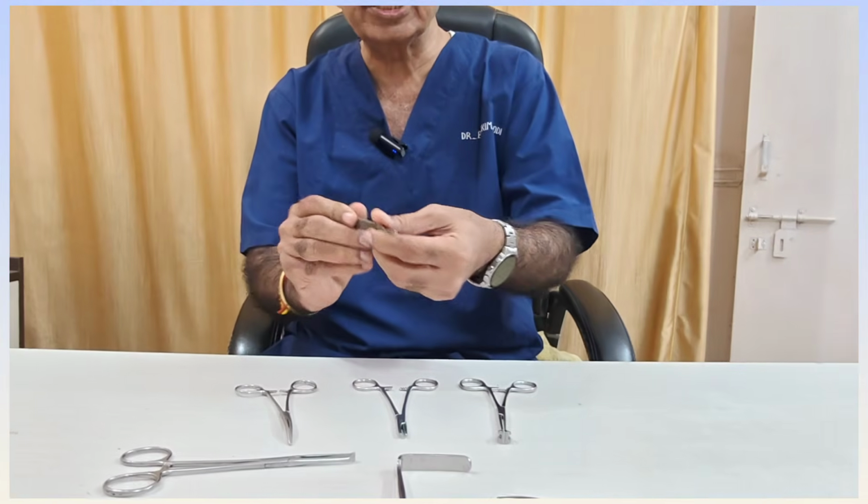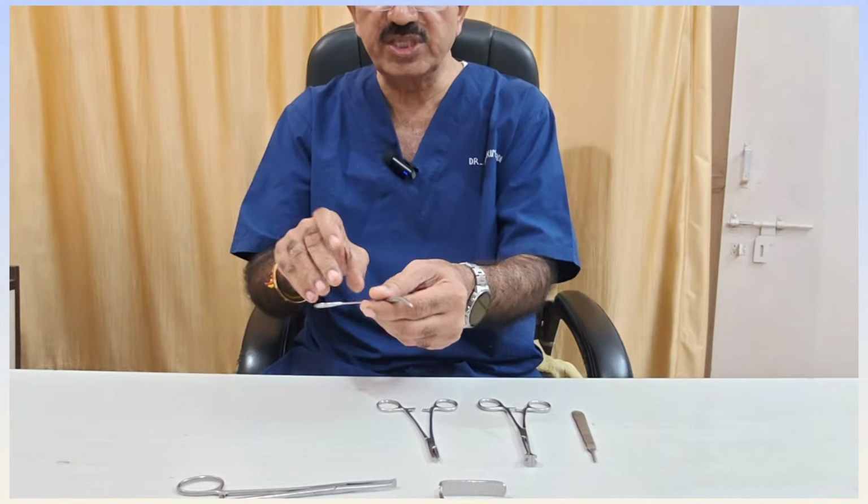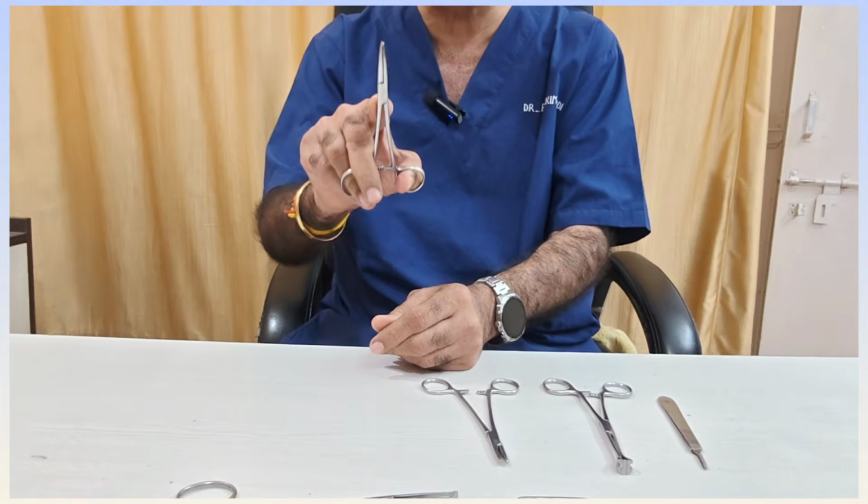Suppose this instrument you have to hold with the pen grip method. That will be the answer to the second question. Any type of forceps, tooth forceps, plain forceps or Adson forceps, should be held with the pen grip. So there are 2 types of grip. My answer to the second question will be the grip: how will you hold it? If this instrument, you hold it with 4 fingers. If it is a forceps, you hold it with the pen grip.